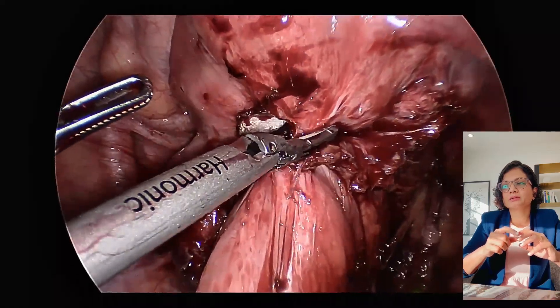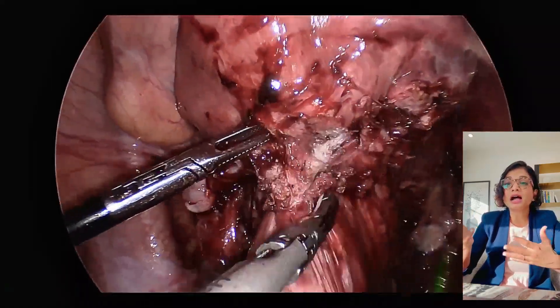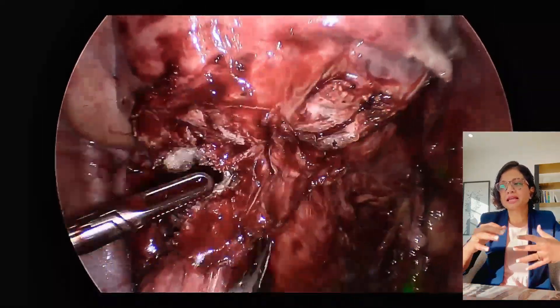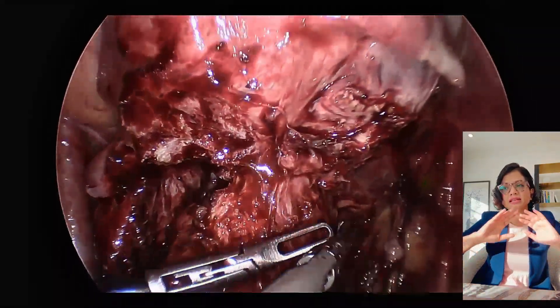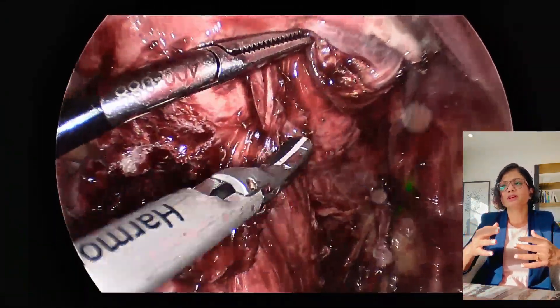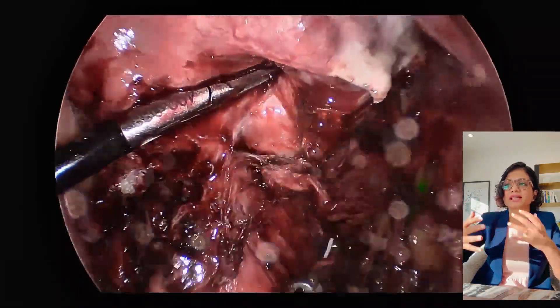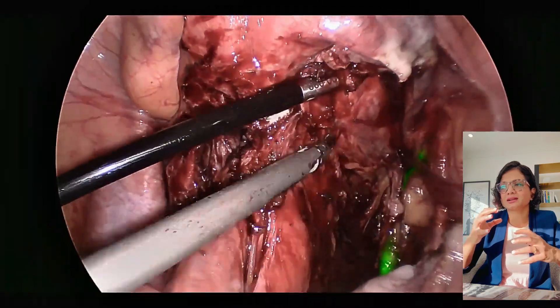These steps are a bit crucial. With preoperative MRI and even what I see here, I can see there's a nodule. Visual cues tell me the texture is a bit different, and haptic feedback — I know I'm cutting through concrete-like material. There are different ways to cut the nodule: you can cut through the nodule, leave most of it on the uterus, or leave most of it on the rectum. Over here I'm cutting through it because it's quite massive and I don't want to risk injury. You can see how the back of the uterus and the rectum have walled off, forming structures that are not normal — we're trying to normalize the anatomy.